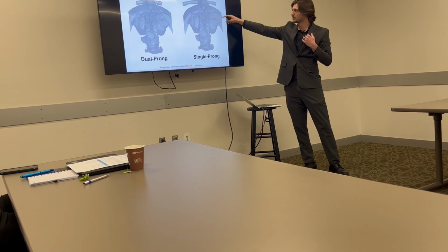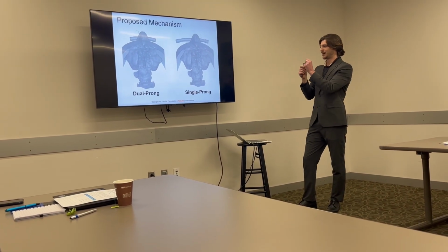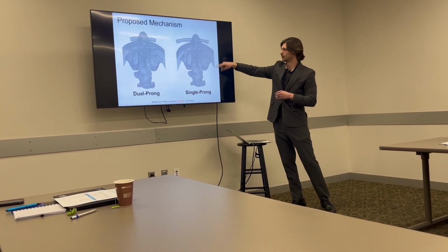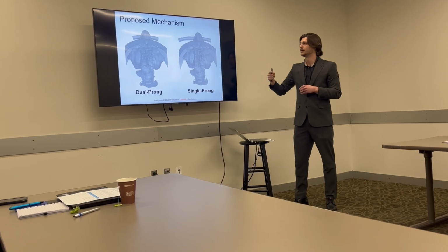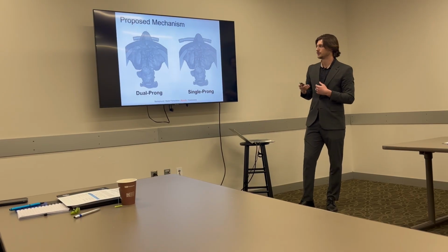And the color of these path lines is changing, or more like path streaks. They're cut off so that you can see the actual traversal here. They're changing as they're mixing with expiratory flow, and the mass fraction CO2 is increasing as it's evacuating some of that CO2 out.